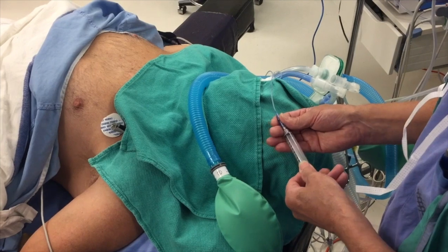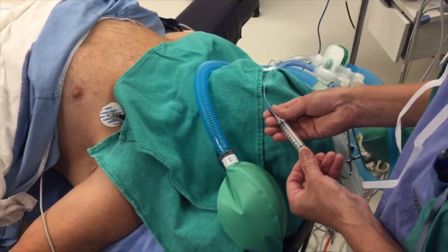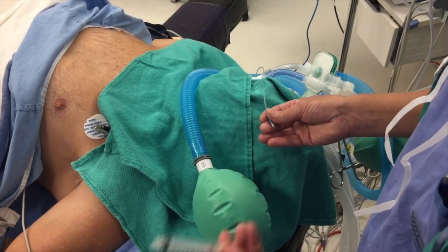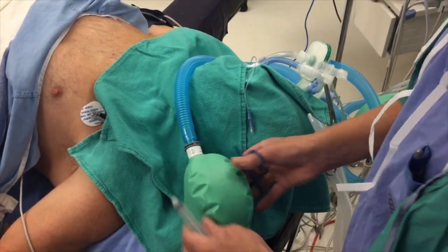So I'm going to withdraw all the air just so we can see how much air we need in the distal cuff in this case. Okay, so there. In this man, this is a 39 tube. Air is still going in. Okay, we've stopped the leak. There's no more leak, as you can see.